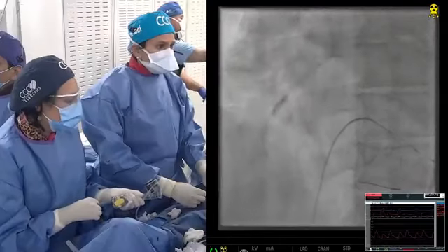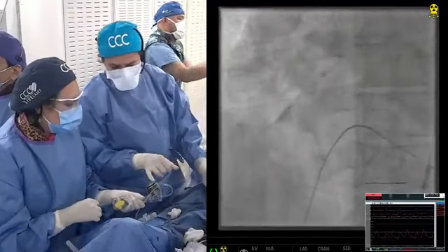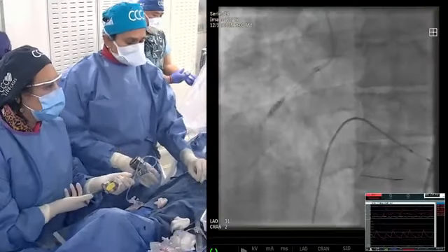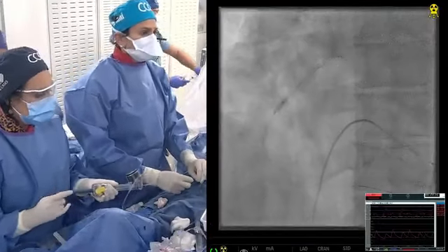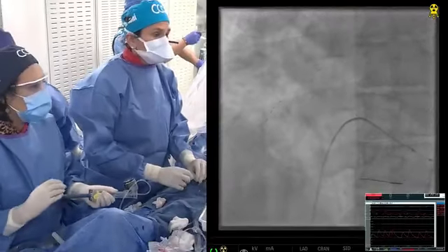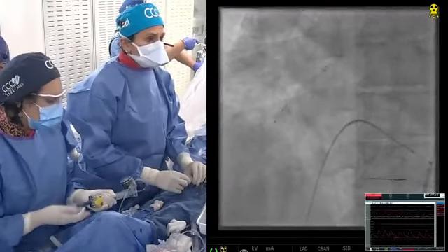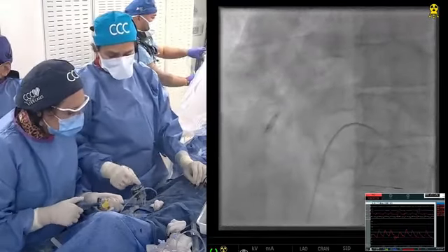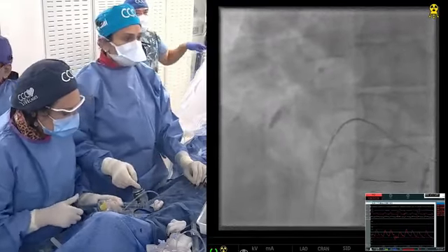Dr. Sharma, do you have any particular preference about the type of cutting balloon? No, I think there is more data for the cutting balloon itself. The scoring balloon probably has the same mechanism, but the second inflation goes a little slow. Yeah, the technique is to go slow.